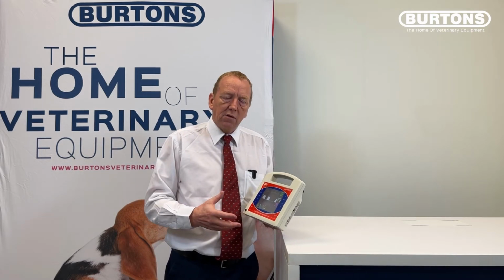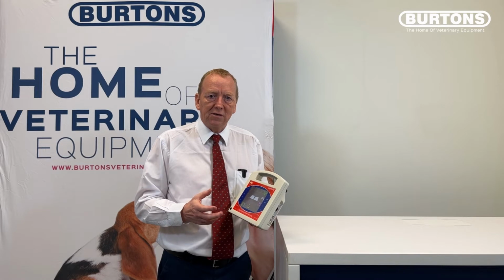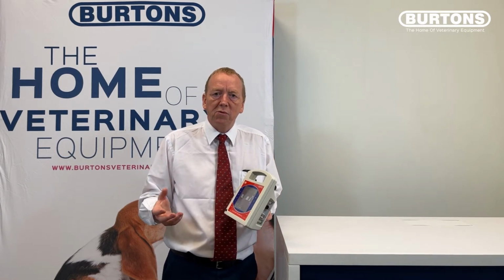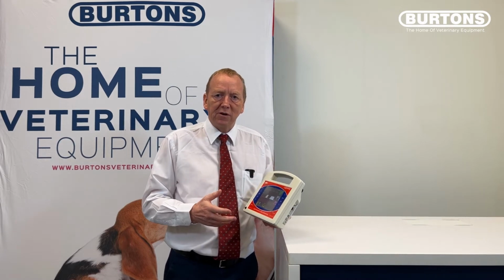The other thing I want to talk about as well is the size of the unit and the screen size. It's very difficult to get the optimum size for a screen or for a monitor. One has a conflict of interest. The one desire is to have a unit as small and portable as possible, and another desire is to have the screen as big and as visible as possible.